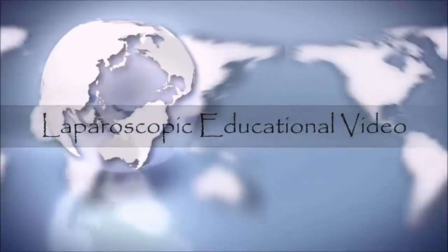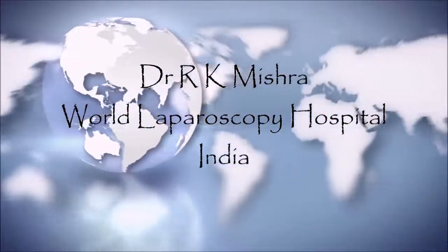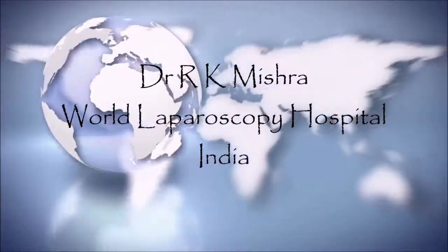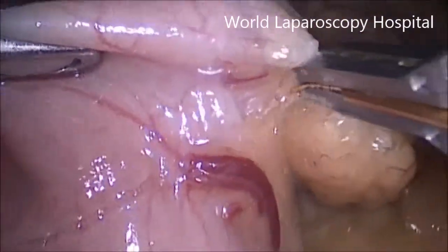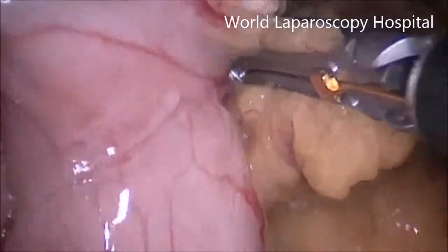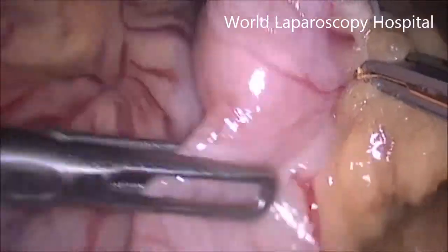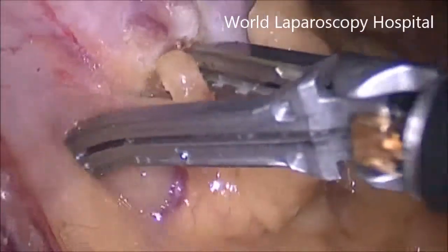Hello, good morning. This is a case of laparoscopic gastric plication for morbid obesity. The first step is that we will start 4 cm away from the pylorus, and all the short gastrics have to be shaved out.